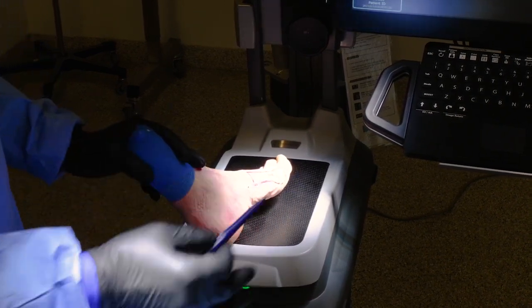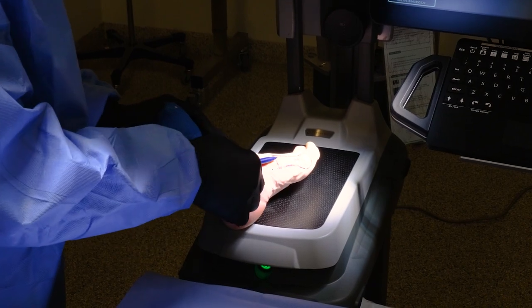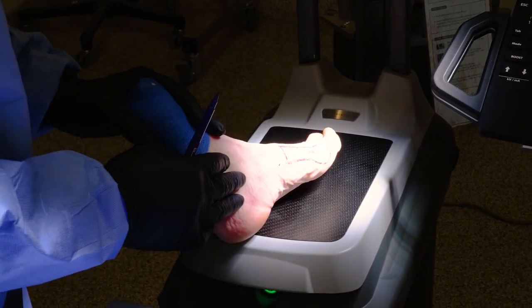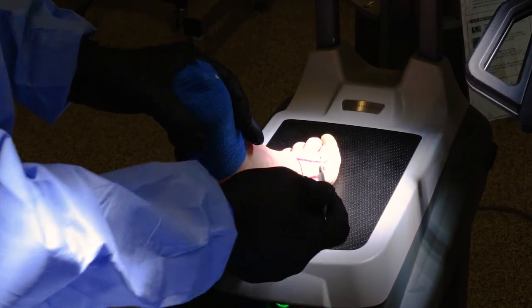I draw out my anatomy — whether it's a femur, a big toe, whatever — especially when doing a minimally invasive technique. Understanding where your head is, where your base is, and where your incision is allows you to have visual feedback on top of tactile feedback on top of fluoroscopy. The first thing I want to do is set where my cut is going to be.